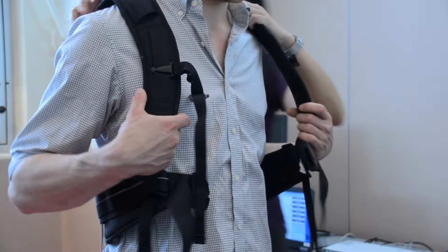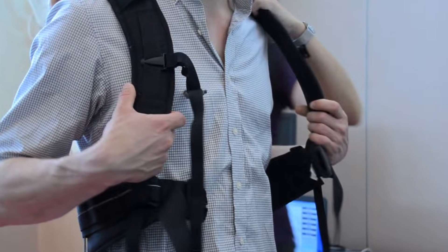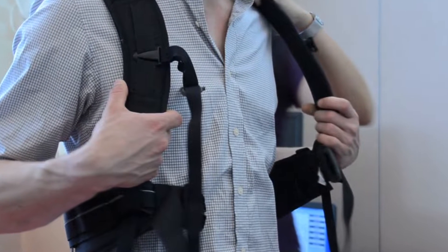The final step is to assist the participant out of the harness and detach the sensors from the trunk and feet.